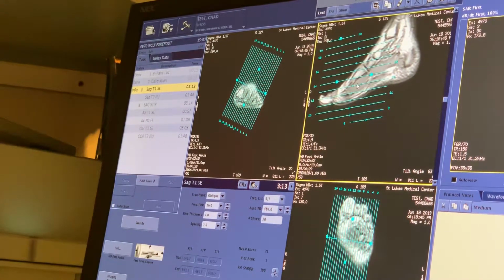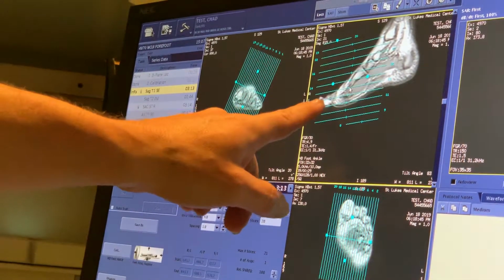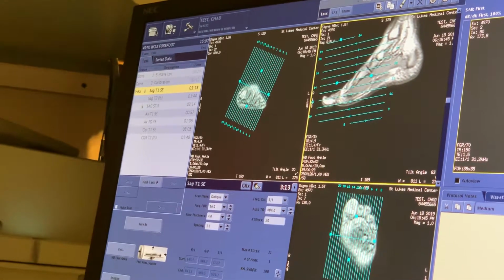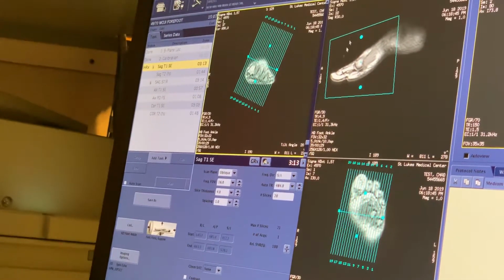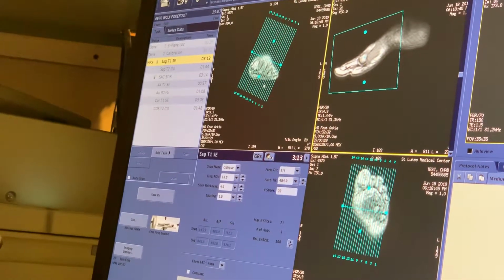I don't know why. I don't know. So I always give it almost half a toe's worth of space out the front, because you do not want to clip that if you can help it. Okay, so this is pretty much how we plot a forefoot, the sagittal on a forefoot. So I've got the angulation done. I've done the centering. Now I do the coverage.